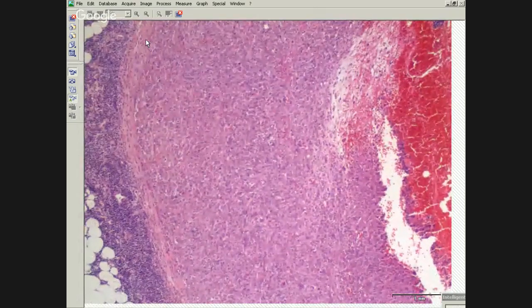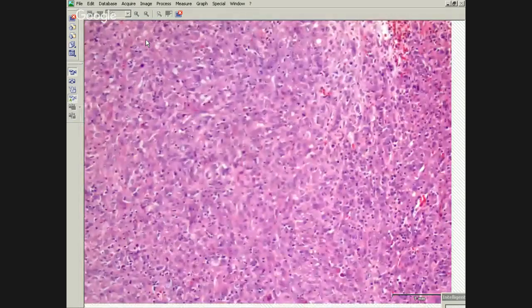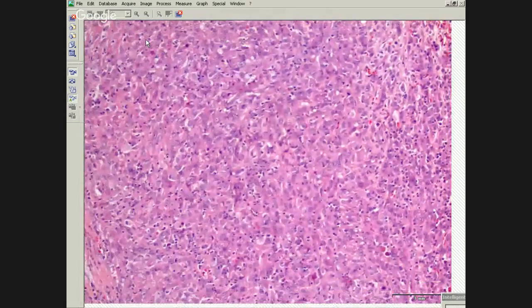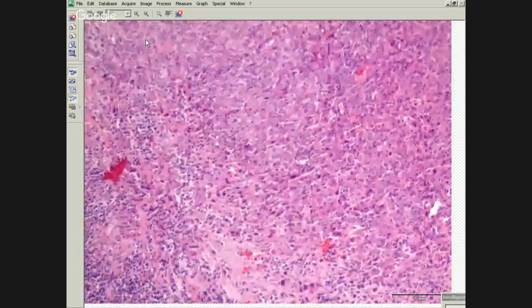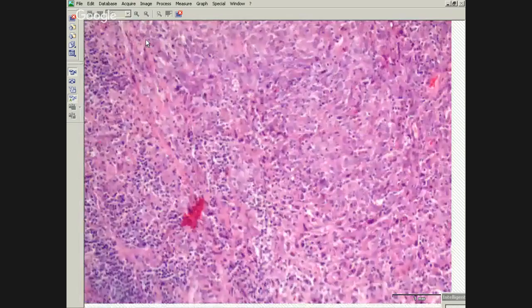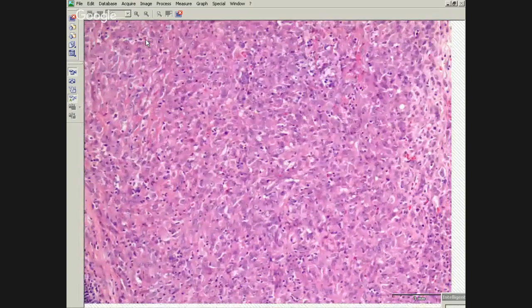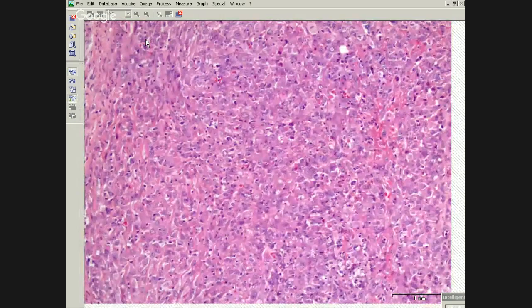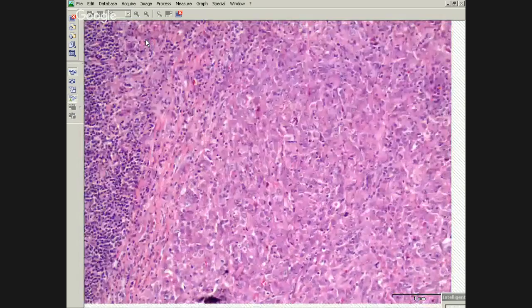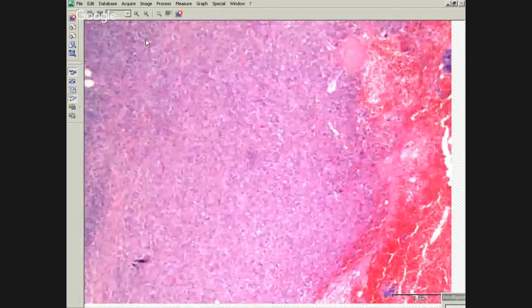This one is cytologically much uglier than the other ones. You have bigger cells. They're a bit more pleomorphic. You can pick out some mitoses here and there that we didn't have in the other one. But what's your differential with this? I would still think of a mesothelioma first. And it is a diffuse process. Epithelioid mesothelioma. Okay. And also, I would like to know more about the history of the patient.